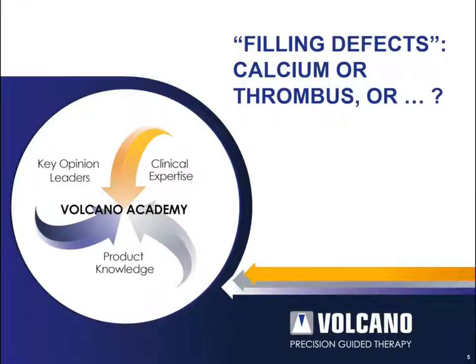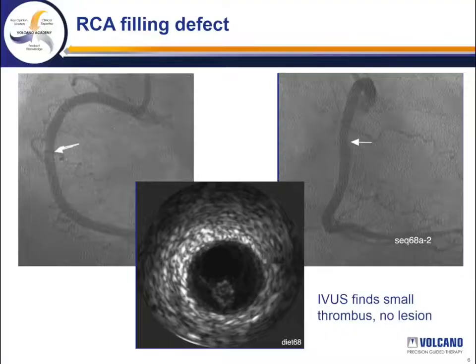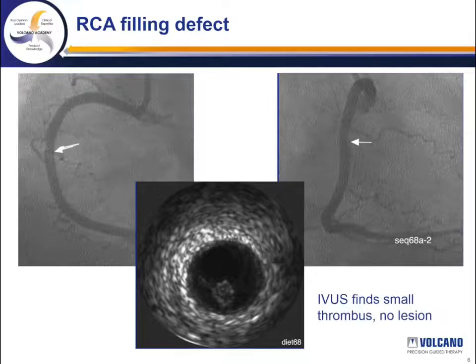Let's start with filling defects. Often the question is whether it's calcium or thrombus or something else. This is a right coronary with a very subtle mobile filling defect in its mid portion in what otherwise looks like a fairly healthy vessel.